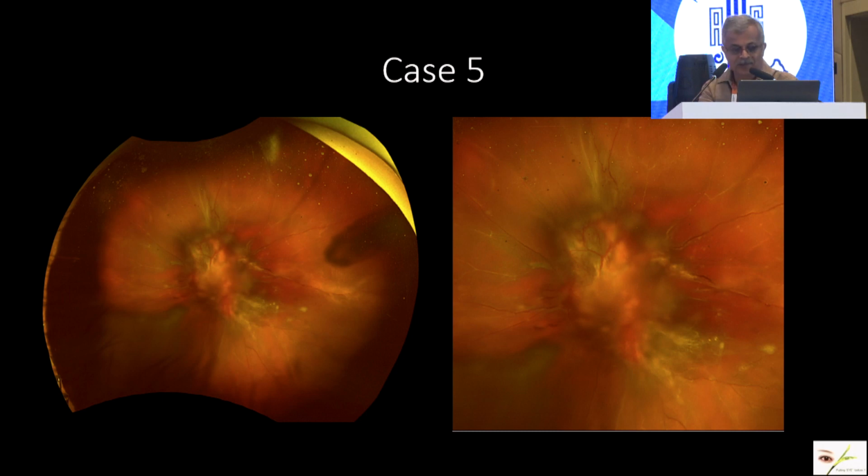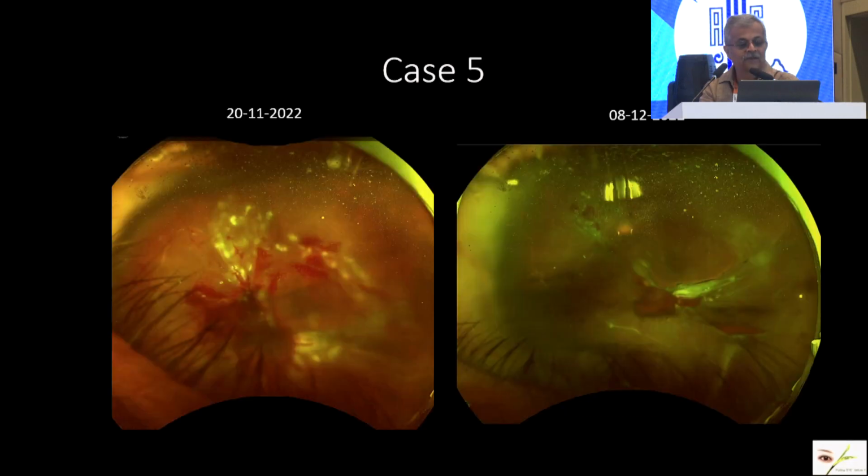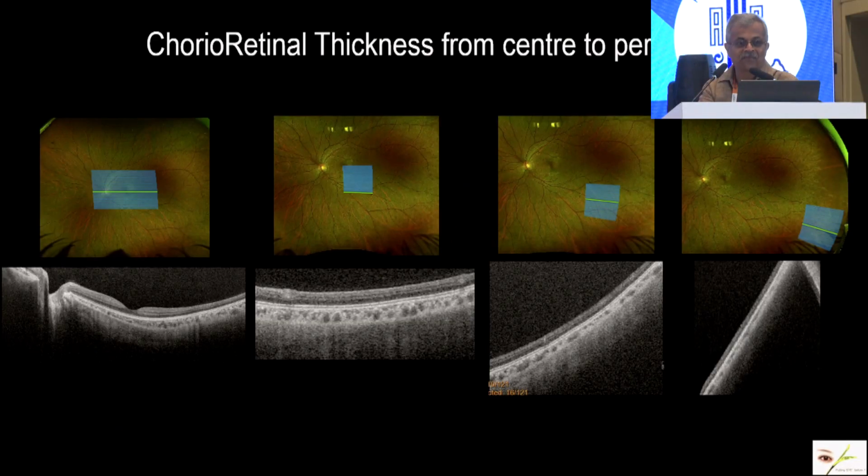retina, and I operated. And again, if you see the OCT here, this is the retina and this is the membrane. You can't separate it. Now, when I did operate, there was a large hole and this membrane could not be totally separated. This is the best we could get. And unfortunately, the patient developed redetachment, which was likely to be there. So having pre-op OCT gives us an idea as to what we are dealing with, much more than what we saw on the table.